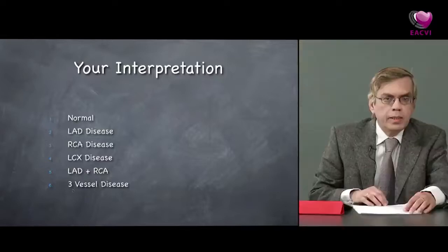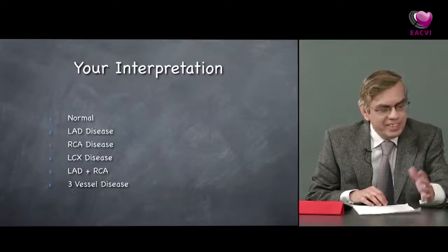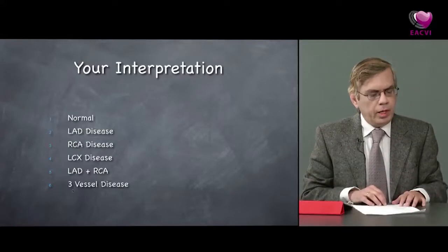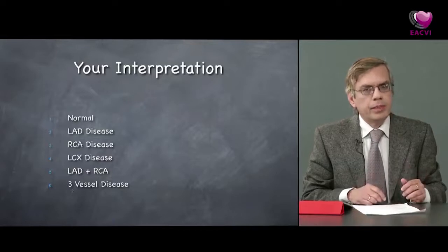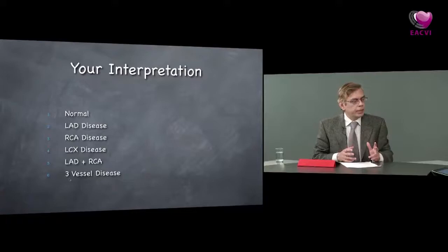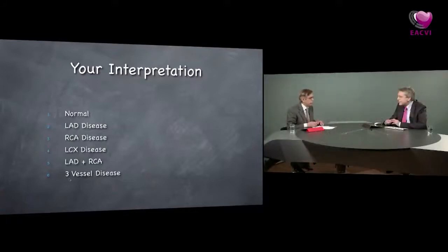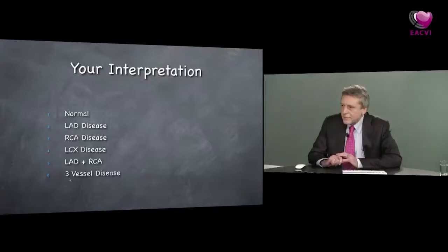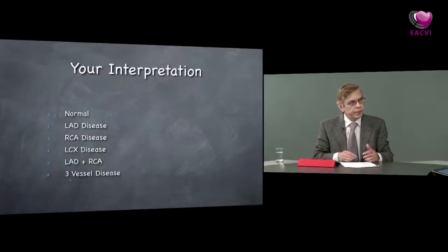That's right. So while they are searching for their answers, we'll have another question answer session. So how do you ensure in your practice, when you do stress echo, that that LVO opacification is uniform and that there are no attenuation artifacts? Because as we all know, with stress echo, we need to see every segment of the heart in order to be sure that it's normal. Yes. So how do you deal with the situation of attenuation artifacts appearing or not getting proper LVO opacification?